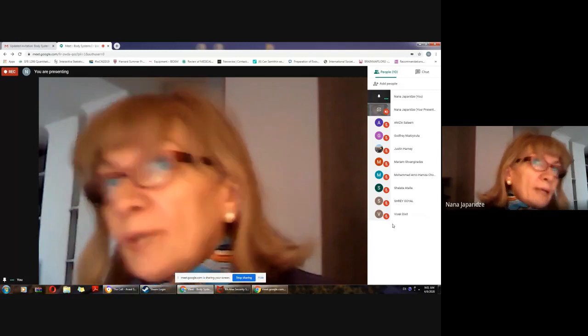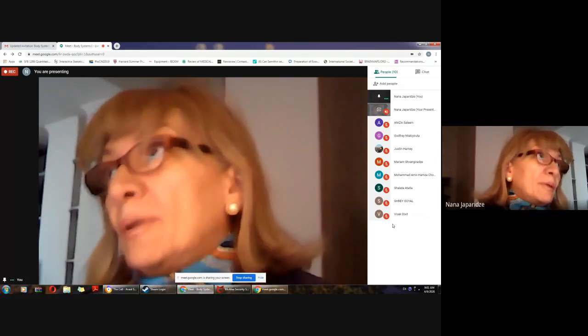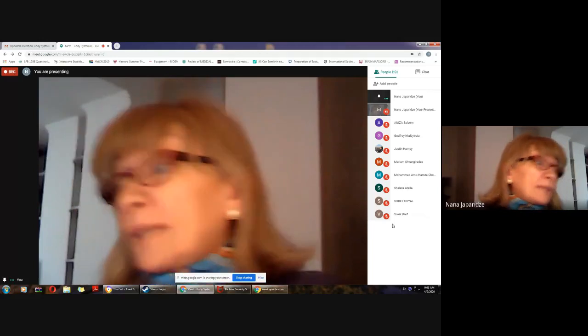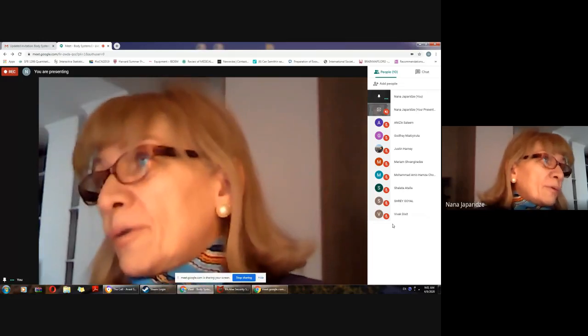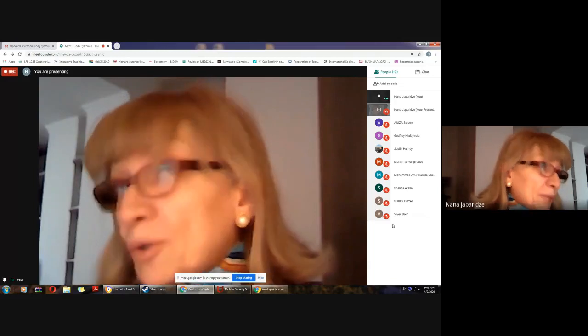But today, I want to talk with you about the different samples, different types of microscopical techniques, and study together with you different tissue samples via virtual microscopy.